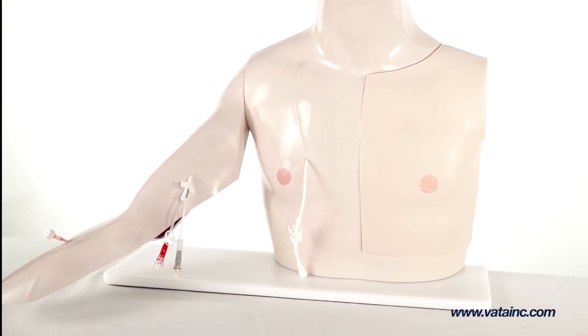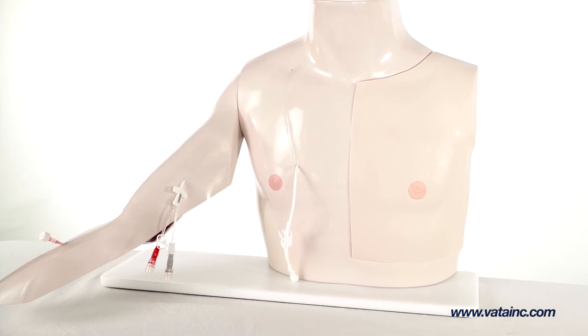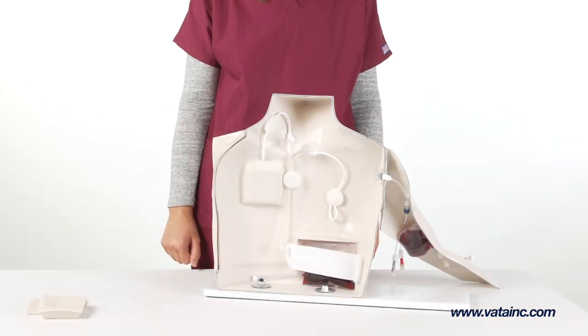Vata's Chester Chest model has everything needed for training and a quick and easy setup. Chester Chest is easy to use and assemble.